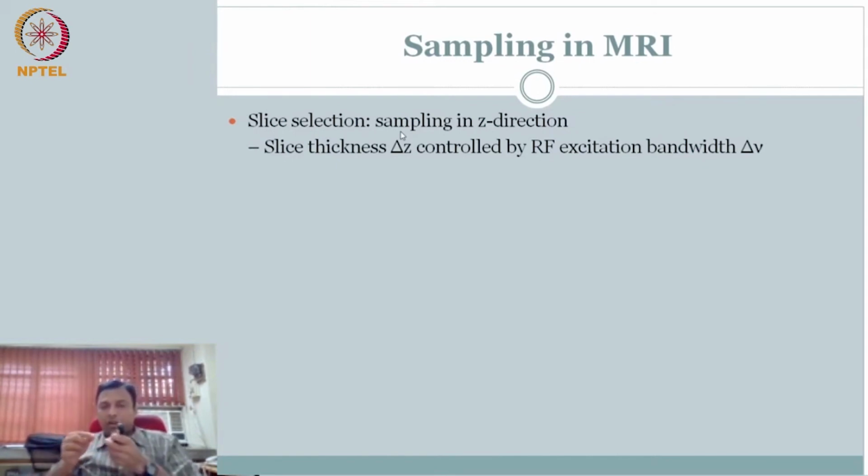And therefore we already talked about blurring within the edge of the slice thickness. So somewhere you already realize sampling becomes an important issue. But we will now focus not on the thickness as much. For a given thickness, because we are interested in the image, even though we know even in the thickness direction there is blurring happening because of your delta Z, right? How you sampled the frequency of your RF excitation is not hard limited, but it has a ramp up and a ramp down. So we leave that.